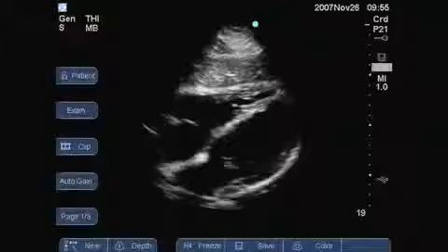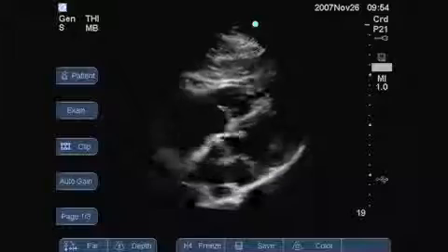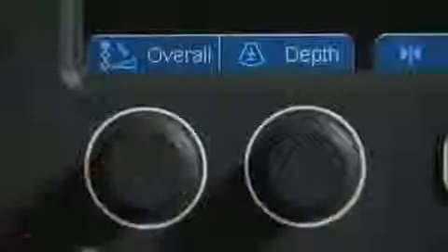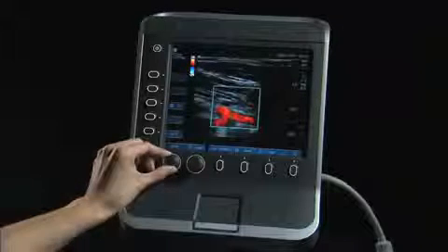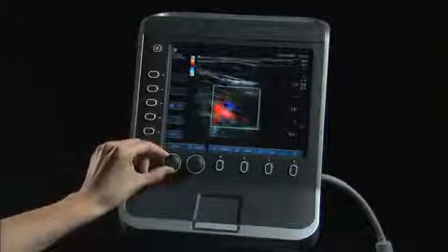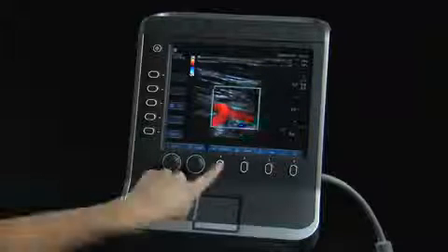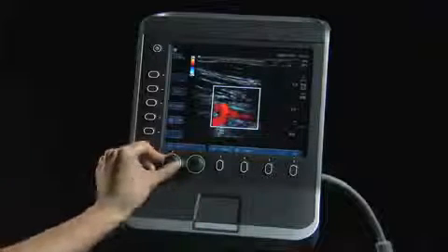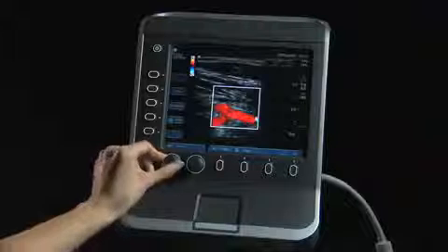Near adjusts the gain applied to the near field of the image. Far adjusts the gain applied to the far field of the image. And overall adjusts the overall gain applied to the entire image. When the system is in color Doppler imaging mode, the first knob controls the overall gain of the color Doppler. When an image is frozen, the gain knob can also be used to review images in the cine buffer. Counterclockwise and clockwise rotation of the knob scrolls backward and forward through the stored images.